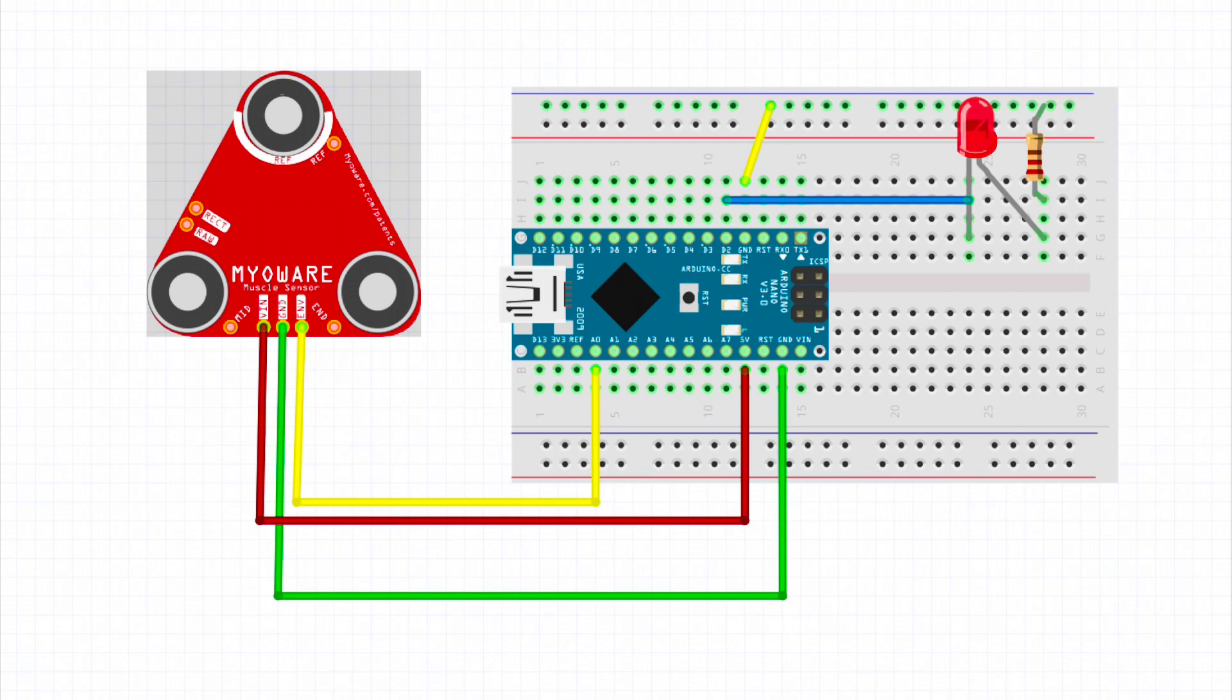This is an overview of our device as of right now. We have a breadboard with our Arduino connected to it which connects to our EMG sensor. We also have our alert system which is the LED light that is connected to our digital 2 output. The alert system works by having the LED light turn on once the EMG signals reach a certain threshold.